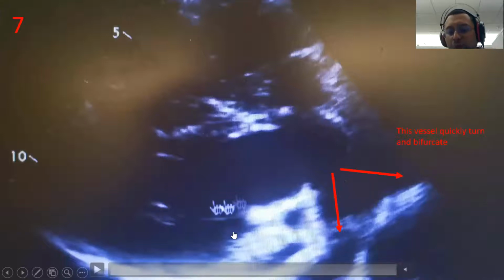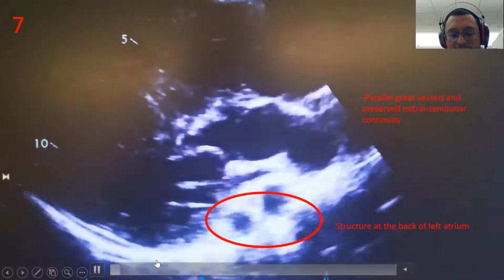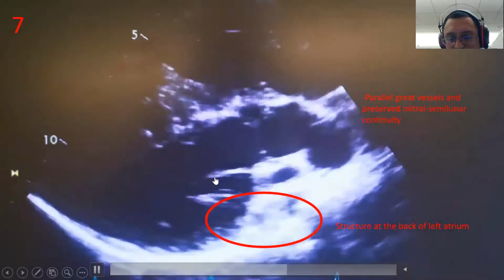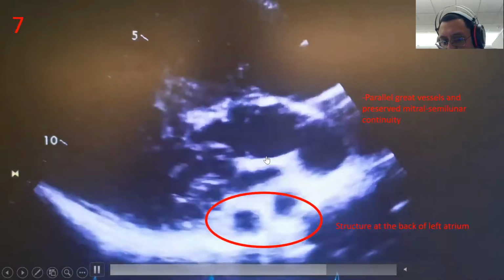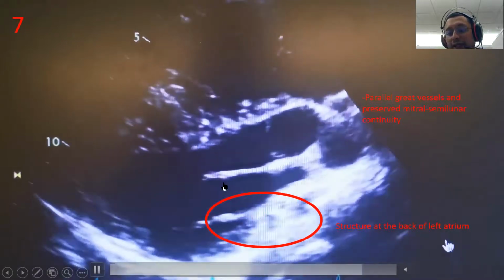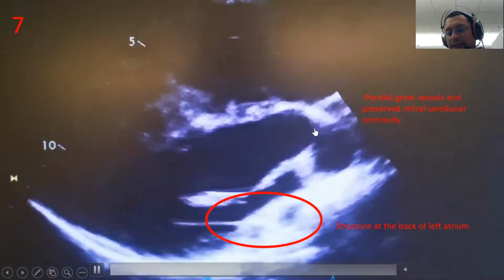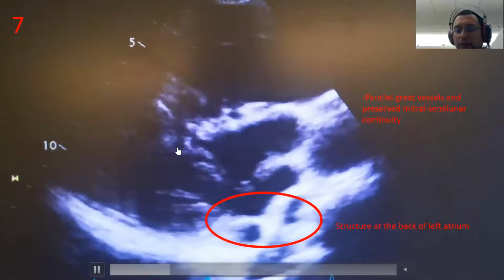Number two, you look at the continuity between the left ventricle and the valve. You see the continuity between the anterior mitral valve leaflet and the valve here. If there is continuity, meaning it is smooth from here to here, then this must be the left ventricle and this must be the pulmonary artery. If this is RV and this is aorta, like in CCTGA, you won't see continuity. I will show you an example a little later. In the short axis AOPA view, normally in DTGA the aorta is anterior and to the right. In CCTGA, the aorta is anterior and to the left.